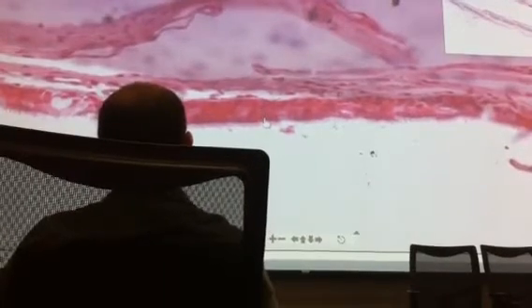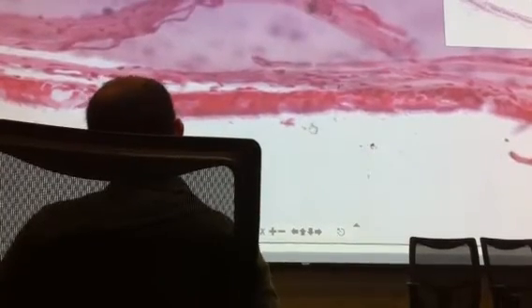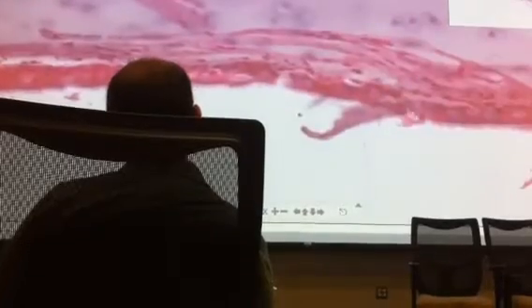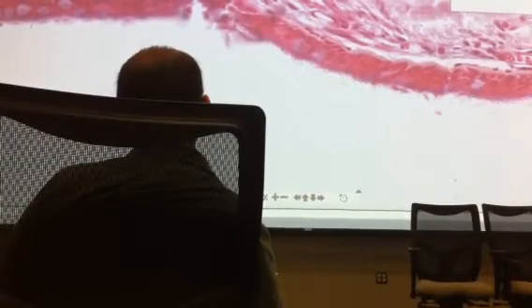But the epithelium is a little low. Typically you'll see more. So the other one's a little bit better for being able to look at the pseudostratified columnar epithelium than this one. But you should at least have a bit of an idea on this one. Don't spend a lot of time on it. Just make sure you can recognize what's different than otherwise.